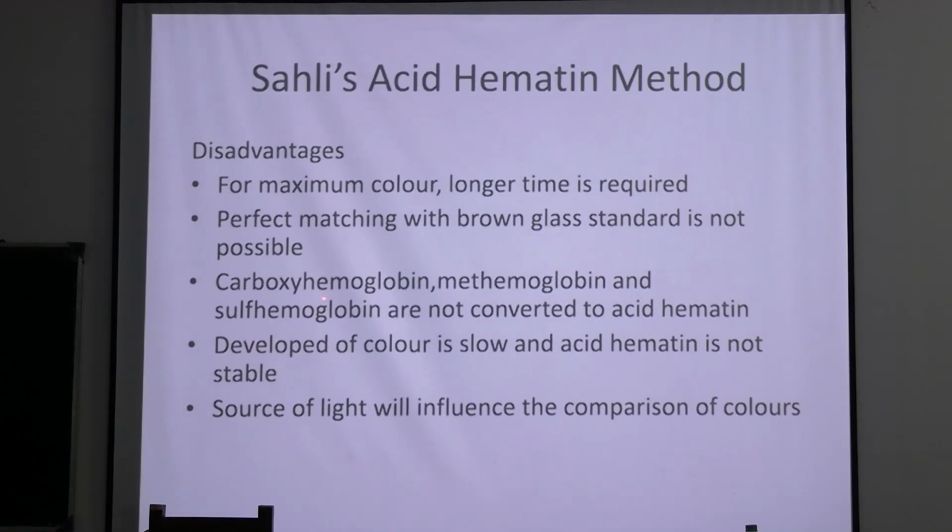It will vary from person to person, there is no standard, and when you repeat it again, it is not reproducible. After 5 or 10 minutes, if you take a sample from the same patient and perform the same method, you might see a difference in the reading. So, getting the exact result every time is not possible. This is the main drawback.